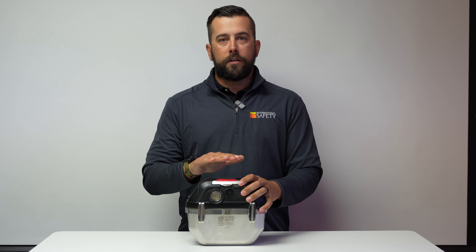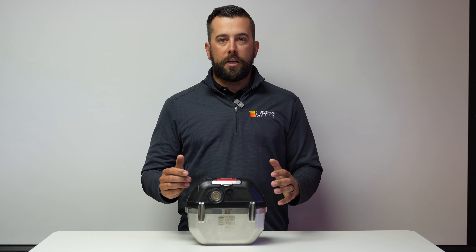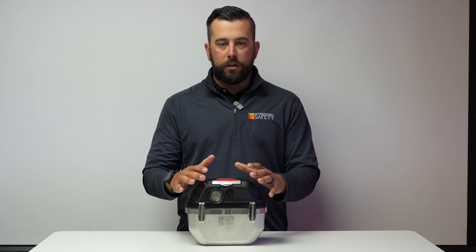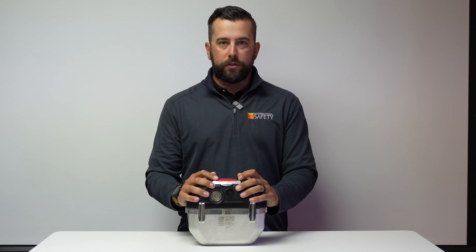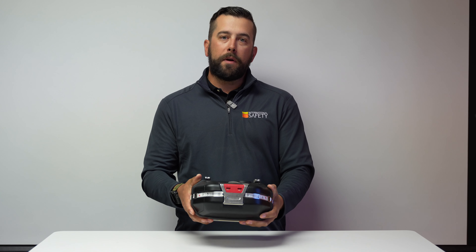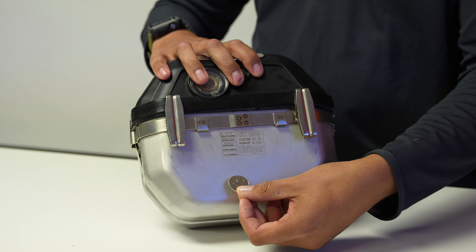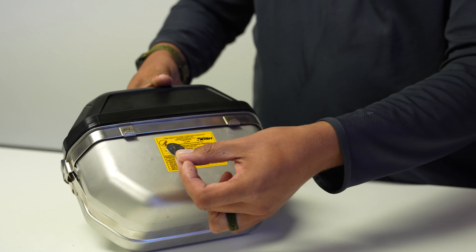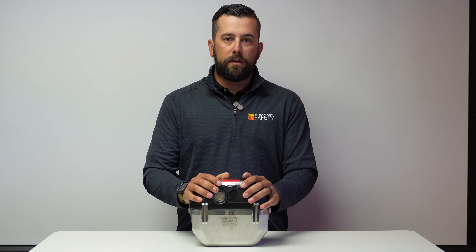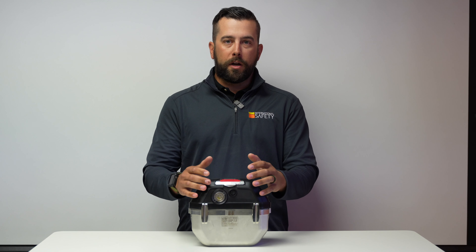I'm going to go through how to inspect your Oxy before each shift. Whether you keep this in a Pelican case or you keep it on yourself, all these checks should be done before each shift, because the last thing you want is for this unit to not perform properly in the event of an emergency. The first thing I'm going to do is look at the unit itself and inspect it for any dents. Dents bigger than about a quarter are the ones you should be worried about. Any dents within the unit itself or any cracks in the plastic top housing — if you see any of that, you're going to want to take this unit out of service immediately and have it either replaced or repaired before bringing it back into service.